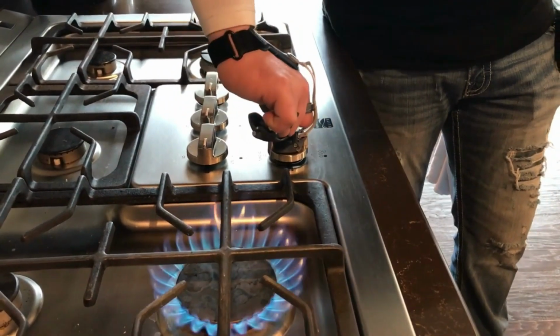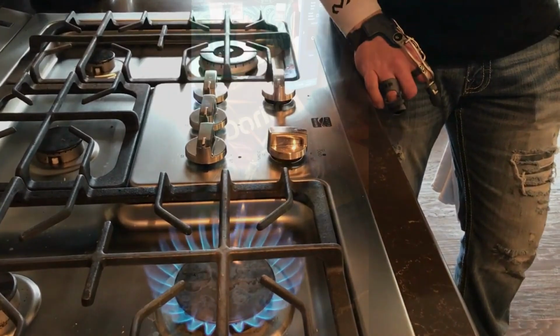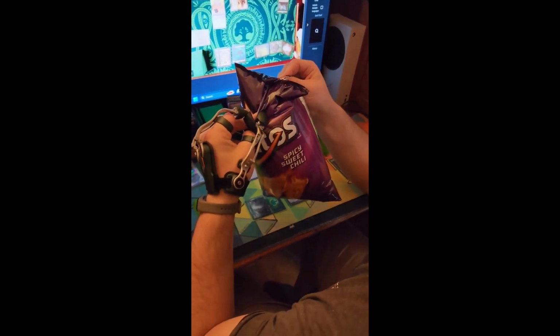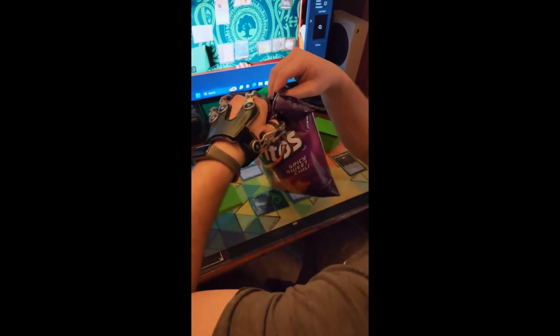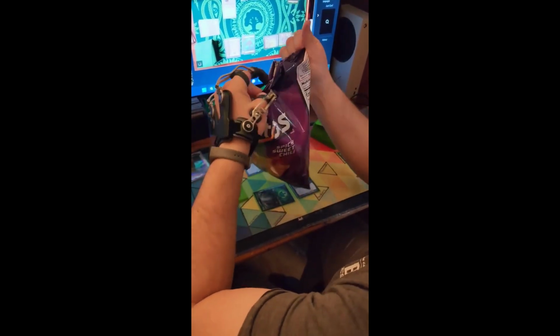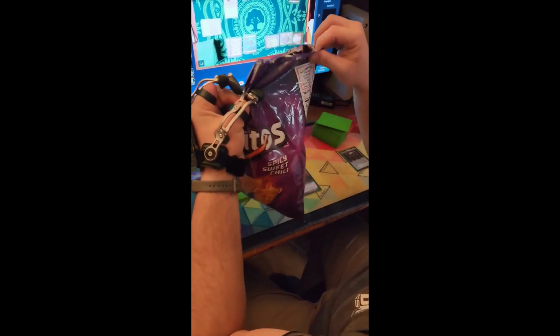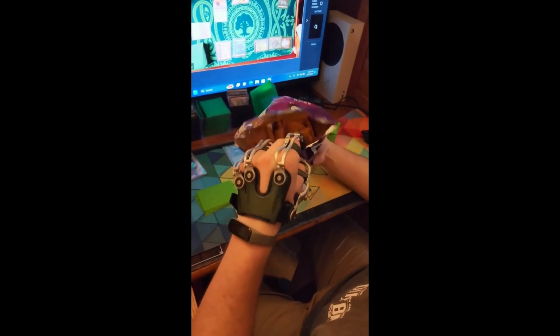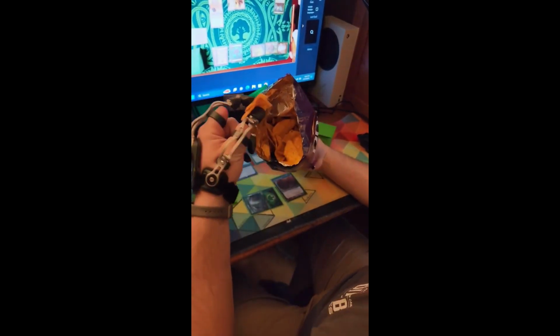I think anybody can understand after having some exposure in the prosthetic world how some devices don't do a whole lot of jobs maybe, or there's a device that's better for this versus that, where these devices are ones that really cover a lot of ground in what the patient's wanting to do, in everyday life and at work.